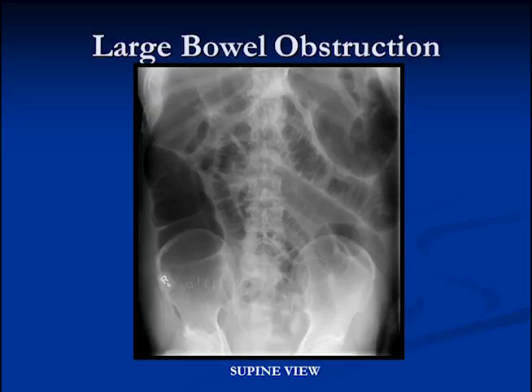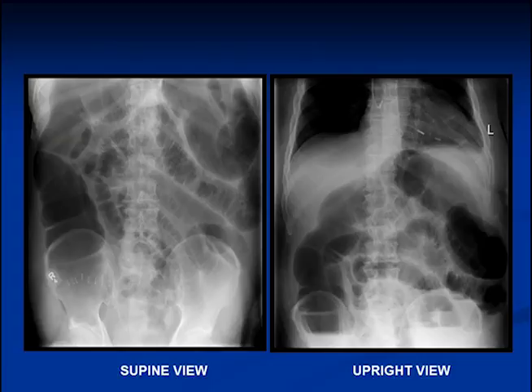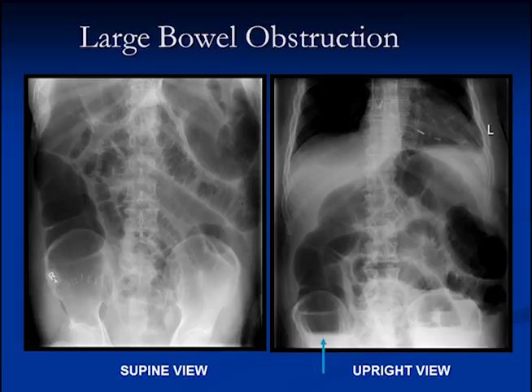The next case is a large bowel obstruction. Here you can see lots of distension of loops of small bowel and large bowel all the way around. There's no air in the rectum and no air in the descending colon, so we would imagine the obstruction is probably at the splenic flexure. We can identify large bowel because the haustra go only partway across, whereas the plica semicircularis of small bowel go all the way around. On an upright view, we can see air-fluid levels in both the large bowel and small bowel.